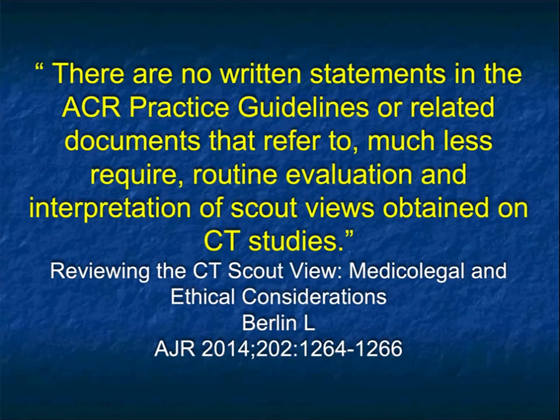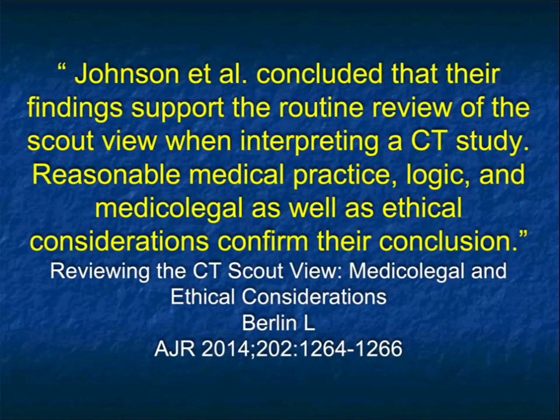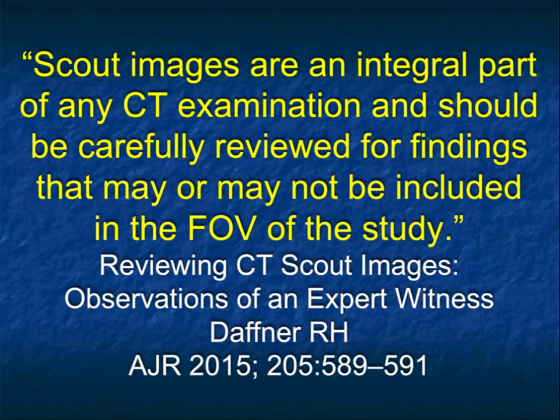Now, Dr. Berlin looked at our results and said, although there are no ACR practice guidelines and 2% seems low, if you extrapolate to 85 million patients who undergo CT each year, it means that as many as 1.7 million patients may have a finding that is seen on the scout view, but not seen on the imaging. And his feeling was reasonable medical practice, logic, and medical legal as well as ethical considerations confirm the conclusion that the topogram must be looked at in every case.